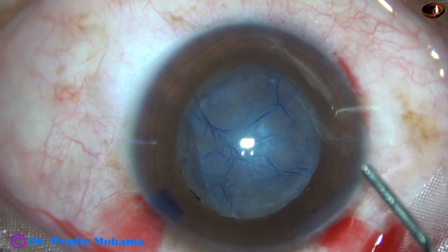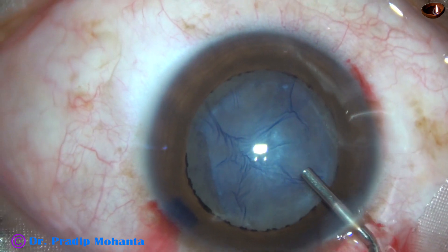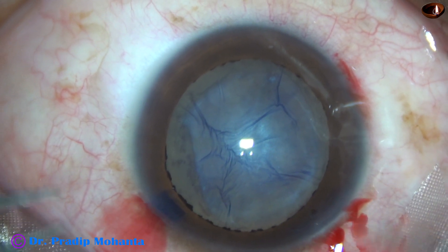So if I go beyond the fibrous plaque, the fibrous tissue, I have to do a rexis of about 7 mm or 8 mm.